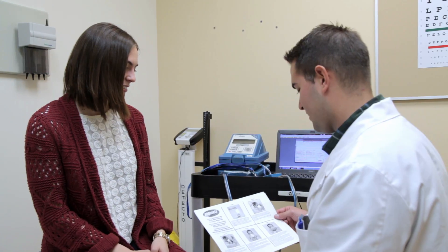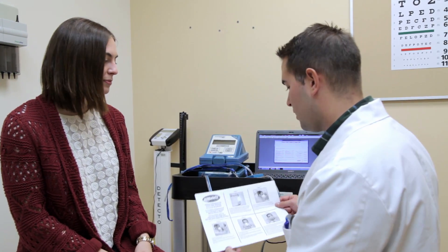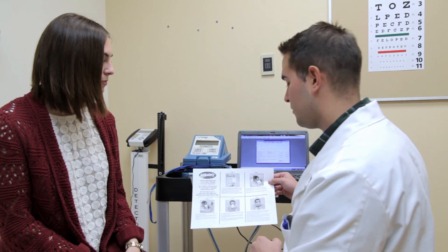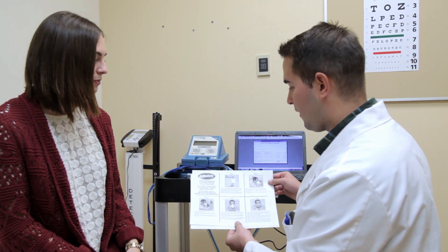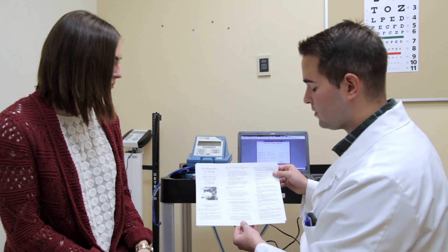Mask fit testing ensures that the use of a respirator or mask meets the individual needs of the person who is using it. Masks are commonly used for protection from respiratory hazards such as silica and airborne pathogens.